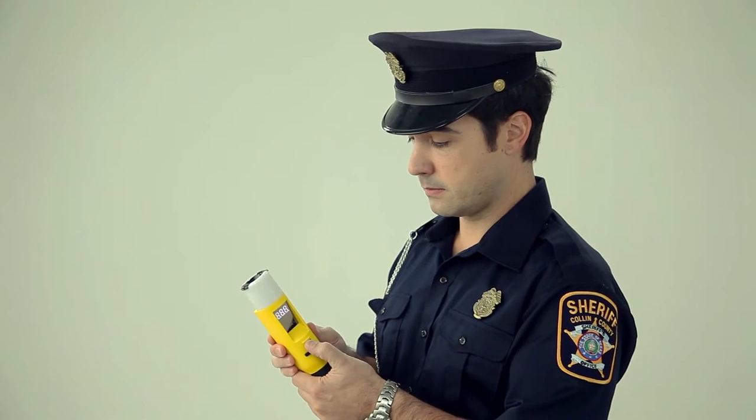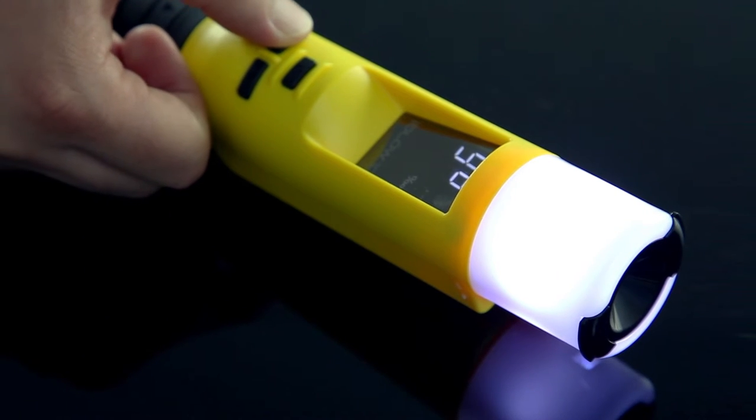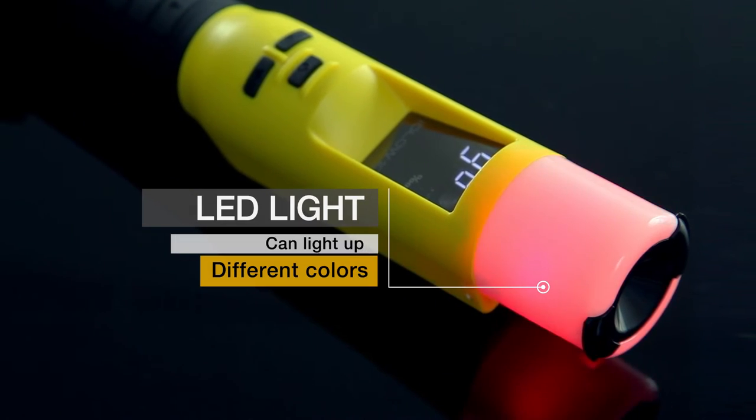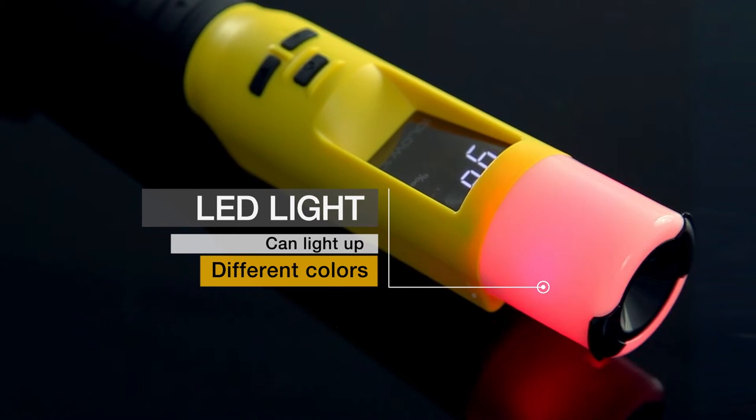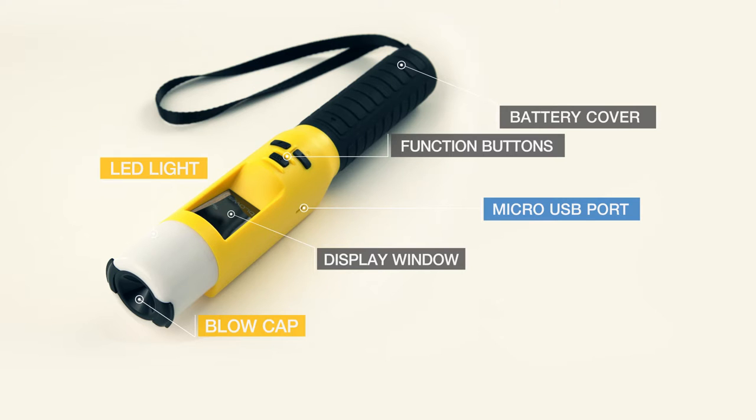iBlow 10 comes with a replaceable blow cap for hygienic use, an LED light that displays results and can light up in different colors, a display window, function buttons, and a battery cover.